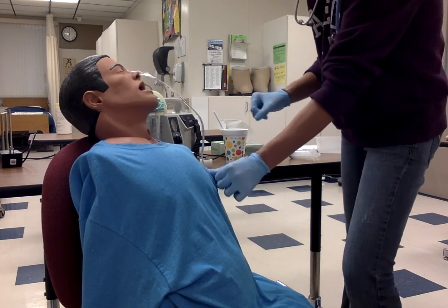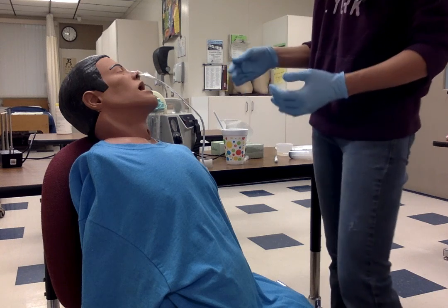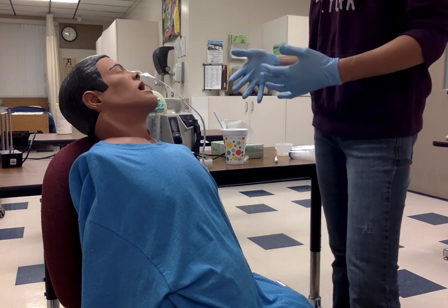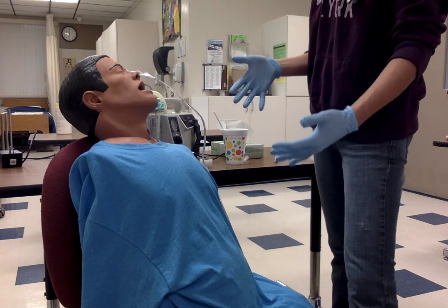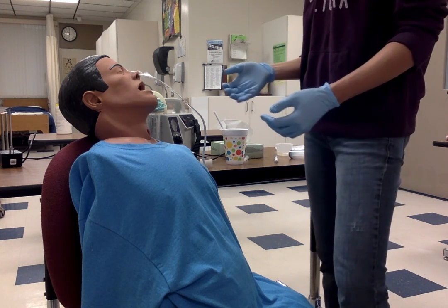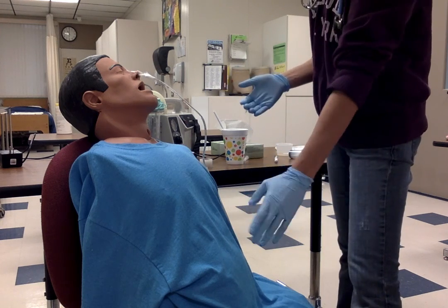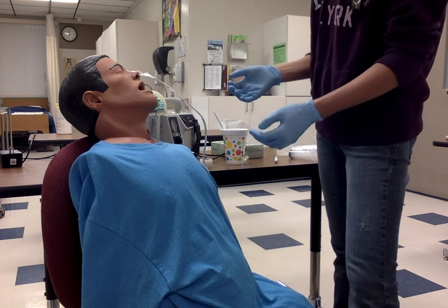And then you want to assess how your patient is doing. Of course, they're not going to be very comfortable, but ask them if they're still feeling super nauseous. Does their stomach still feel distended? More than likely, if they have secretions flowing out here, they're going to get some relief from that.